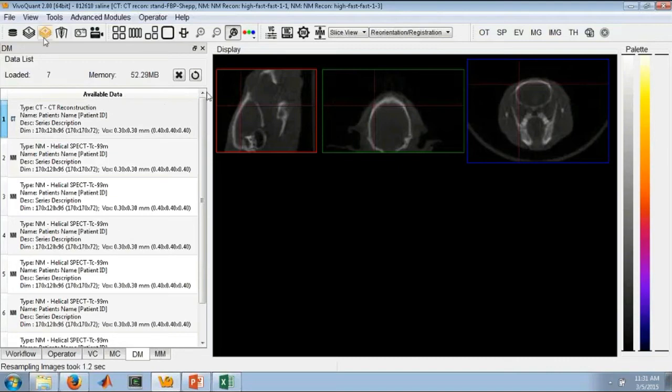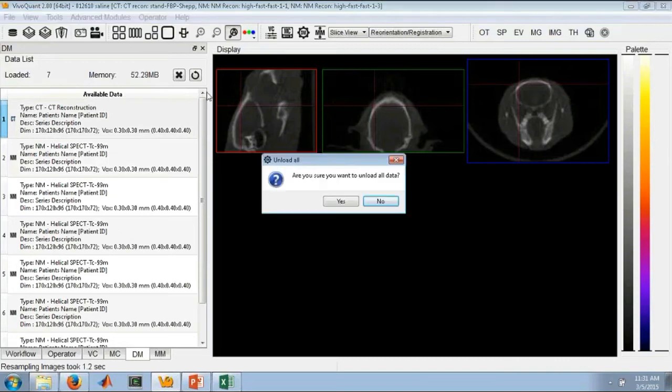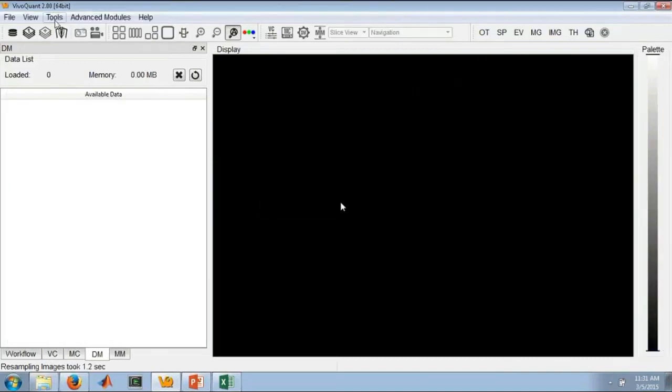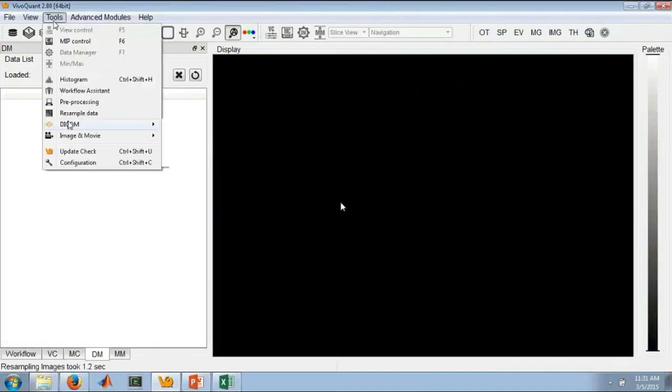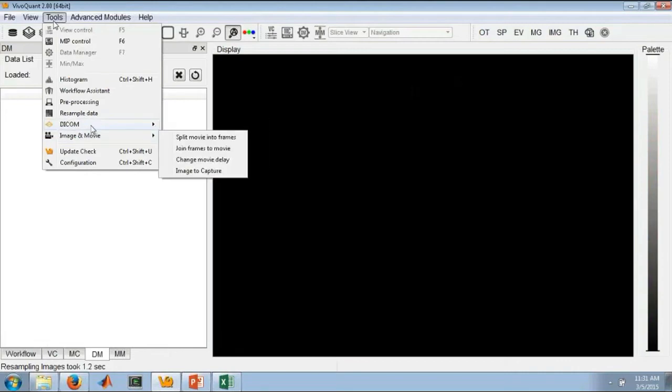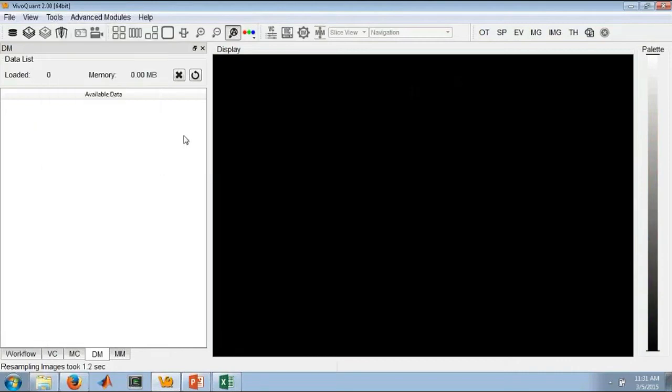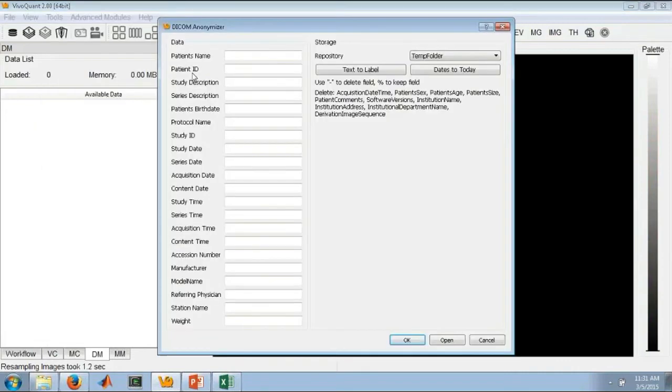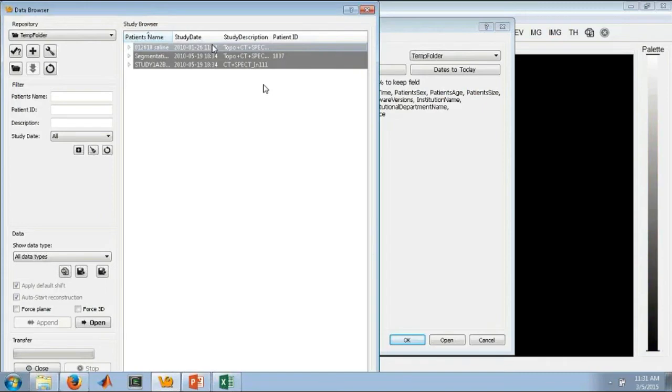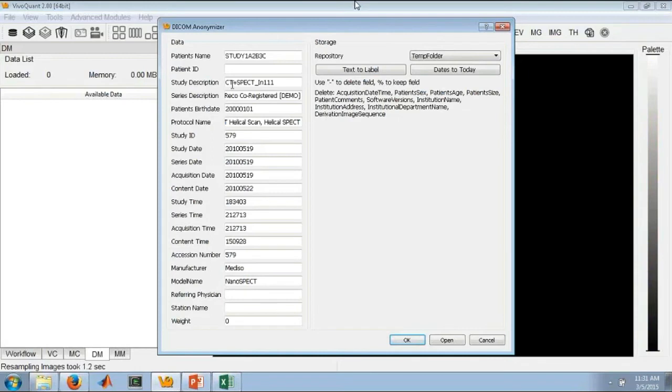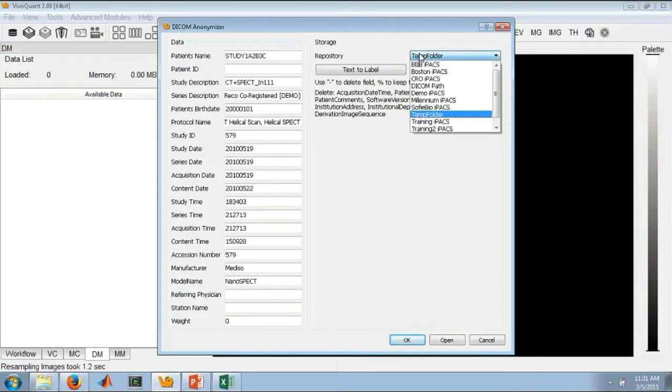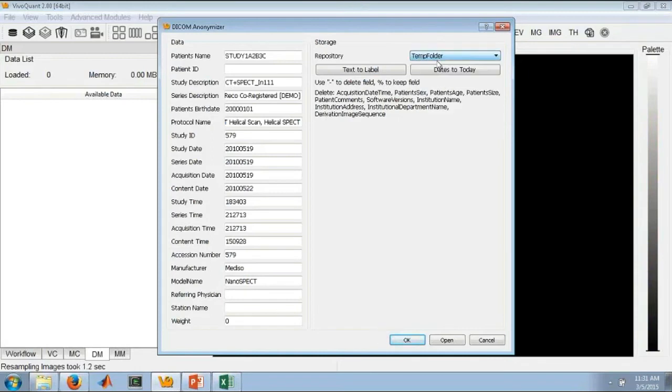We do, however, still support selecting the DICOM anonymizer and then loading data from an existing repository into the anonymizer. And then you can store it to an existing IPAC repository.